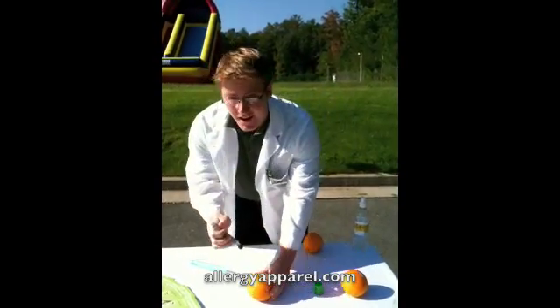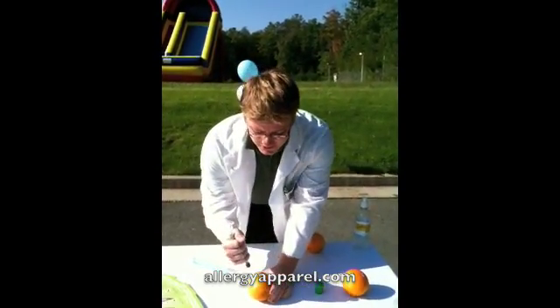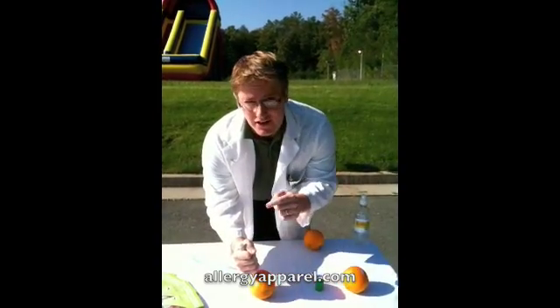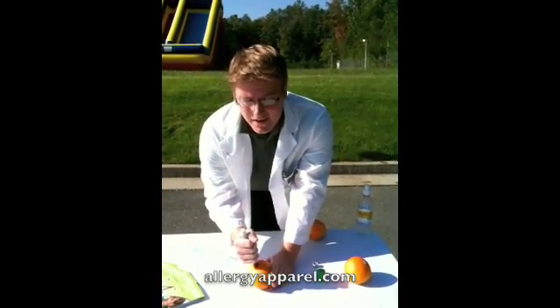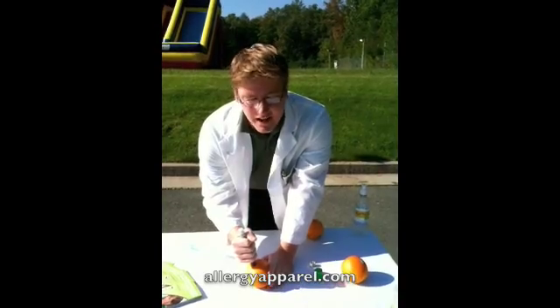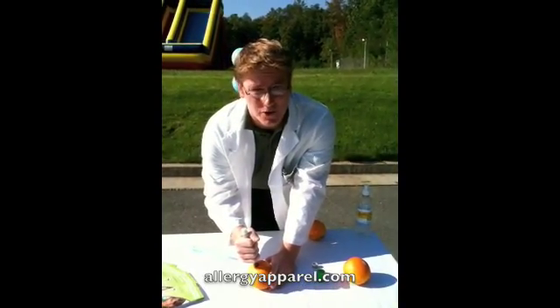Now I am going to do this live on the orange. You are going to take your dominant hand, give it enough force, and you are going to hear a click. When you hear the click, you know the needle has actually injected into the skin or the thigh. You are going to hold it for 10 seconds — not too long because you need to call 9-1-1.